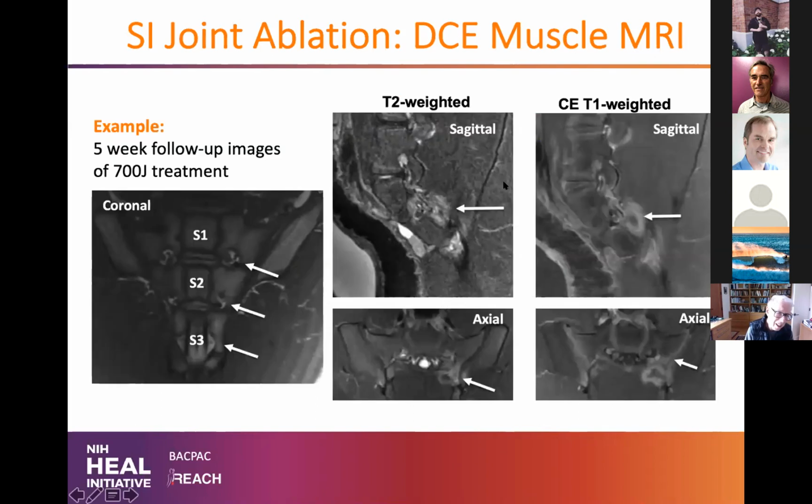And so again, how does delayed contrast enhancement look in the muscle? So on the right side, you can see here that again, it's the same effect. You see a dark spot in the middle, so there's not much penetration of a contrast agent because of necrosis. And then you can see here this white ring outside where the contrast agent accumulates. And then also you can see here again on the T2 weighted pre-contrast images, a lot of fluid and edema going on.